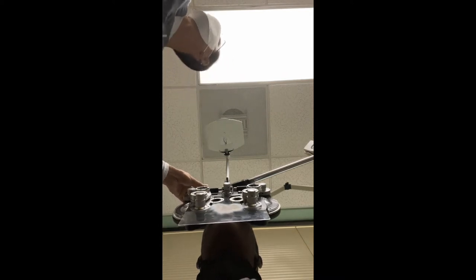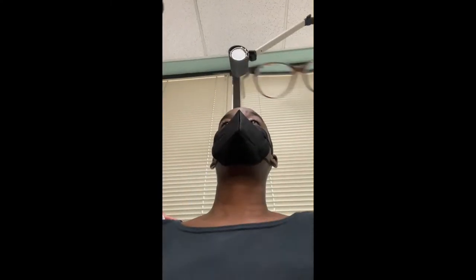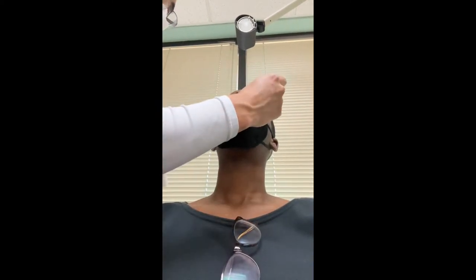Pull your mask down — open your nose. I'll work on the right eye, let's make it as clear as possible. Go ahead and read that line for me. F, Z, B, D, 4. Let's sit back — this is really good, I'm happy! You checked your thickness and Dr. Mandel went over all this with you, right? We looked at my cornea — it does look thick enough, right? Yeah, it looks thick enough according to me. So nothing has changed since last visit. It's going to check to see how dry your eyes are — look up with your eyes only.